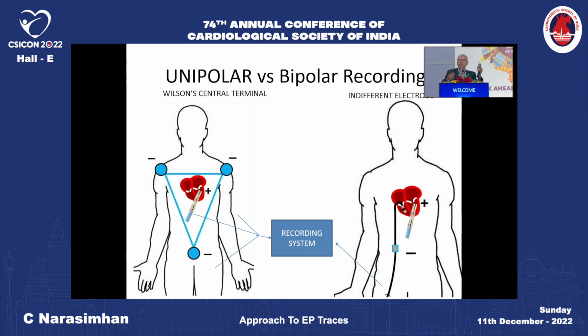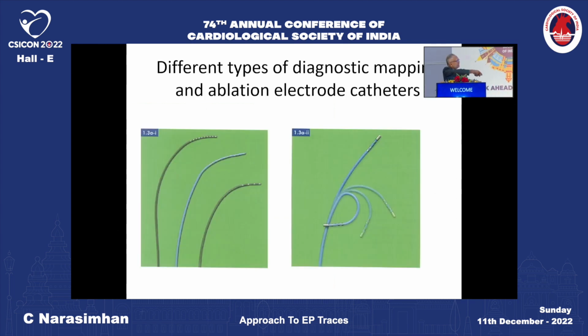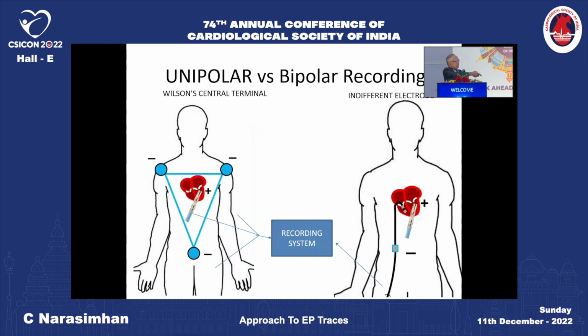If you take two electrodes, there are several electrical noises from head to foot. How do I think? It's some cerebral activity, which is an electrical signal. Electromyogram is a different electrical signal. If you set the electrical frequency to 0.01 to 100 hertz, you pick up the electrical signals that come from the heart. And that is what the ECG does. When you set the filter setting, you ignore all the electrical signals, EEG, electromyogram, and selectively tune in and pick up the myocyte potential if you set up that frequency.